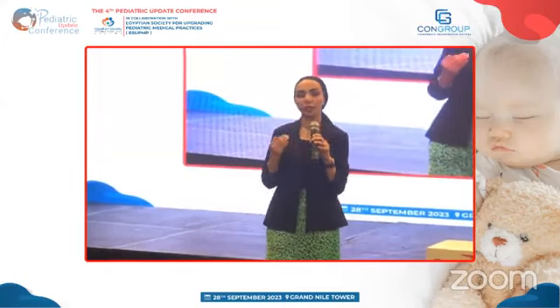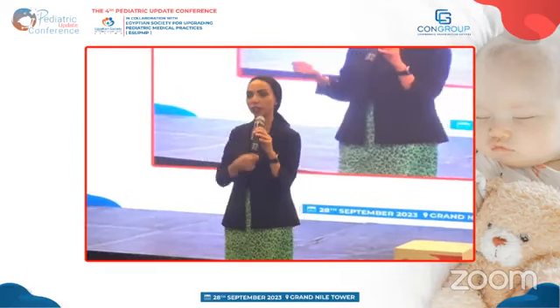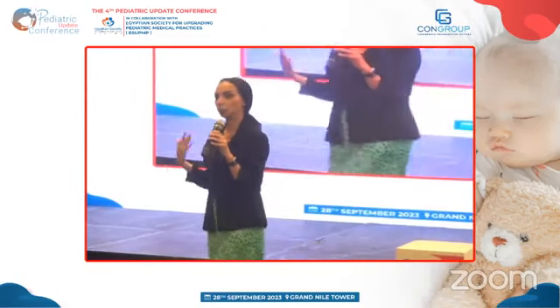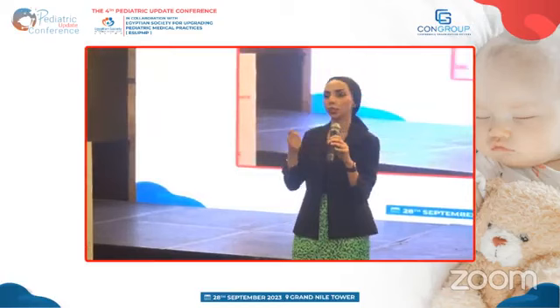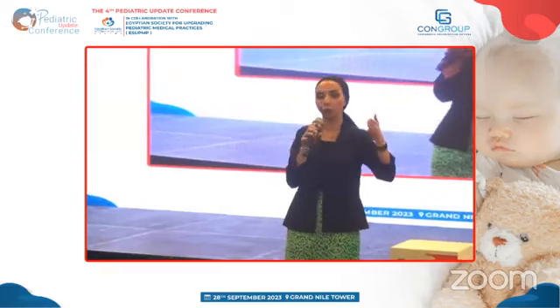البيزل دلوقتي، لو انا عدلت فيه هيعمل امباكت على الالجوريزم او هيغير حاجة في الاوتوماتيك؟ المانيوال بيزل اللي محطوط على البامب في المانيوال مود، لو انا غيرت فيه هيأثر لي على الالجوريزم او في الاكشن بتاع البامب؟ تغيير البيزل المانيوال بالظبط كده ملوش تأثير على البيزل الاوتوماتيك اللي بتشتغل بيه. طيب انا ليه بحتاج ان انا من وقت لوقت ادجست المانيوال بيزل؟ علشان لو حصل اي ايفنت والبيشنت بتاعي خرج من الاوتو مود للمانيوال مود ما يبقاش الجاب بعيدة قوي ما بين التو سيتنجز.